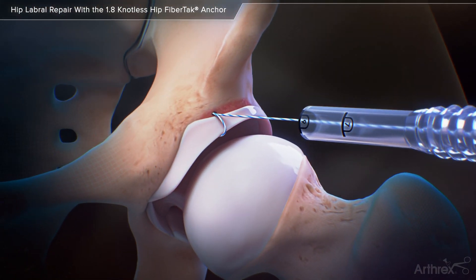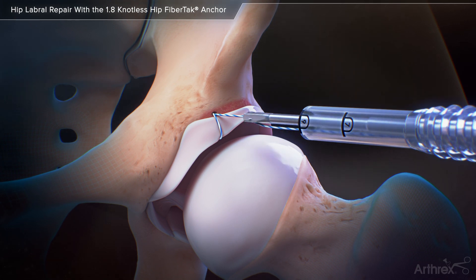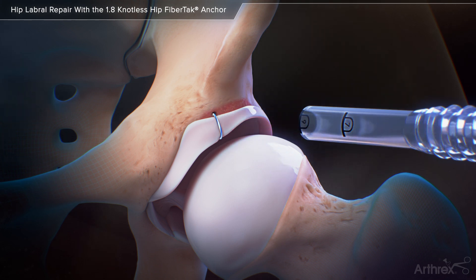Pull on the repair suture to get the initial tension. Outside of the cannula, load the repair suture into the suture cutter for final tensioning and cutting. Insert subsequent anchors to complete the labral repair.